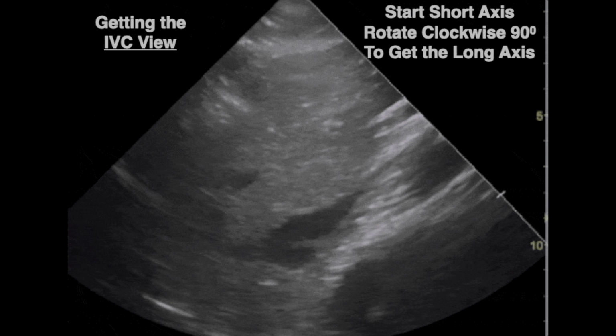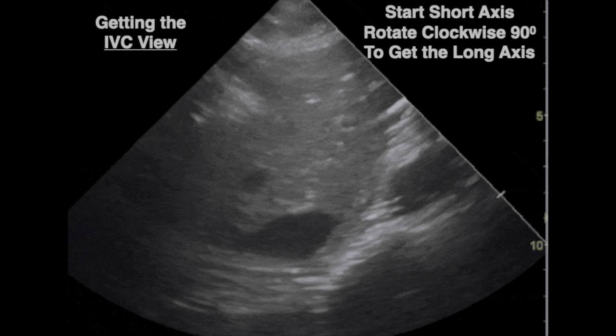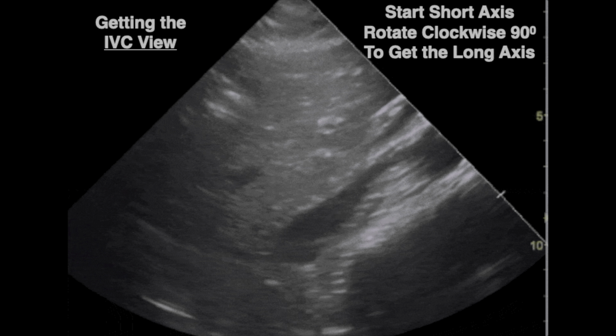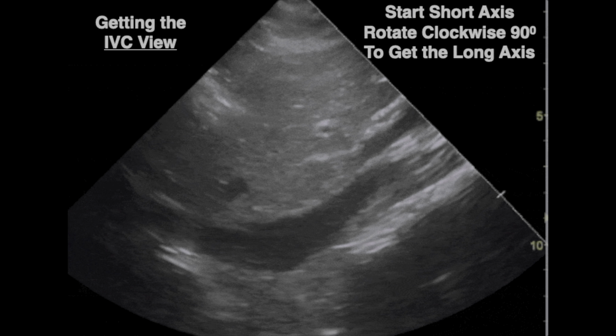Once you have obtained the IVC view, you will need to assess for IVC collapsibility. For spontaneously breathing patients, have them take a deep breath or have them sniff in. The maximum IVC diameter will be seen during expiration, and the minimum IVC diameter will be seen during inspiration of these patients. For ventilated patients, the effect will be opposite. The maximum IVC diameter will be seen during inspiration, and the minimum will be seen during the expiration.